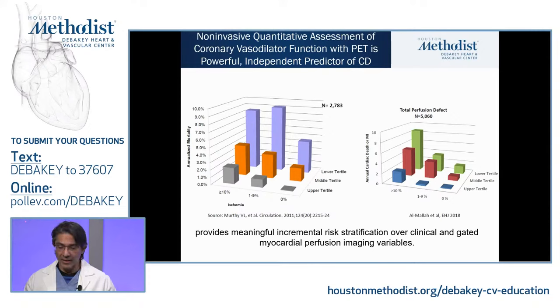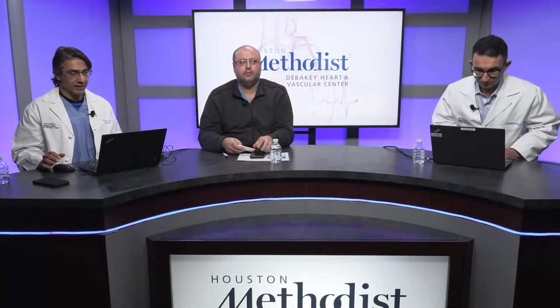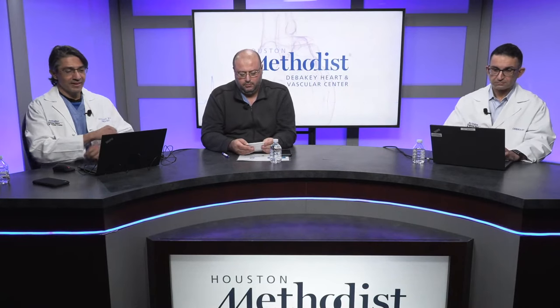Also, if you add to that what your coronary flow reserve is, you can also see further stratification. So coronary blood flow can be a very powerful prognostic independent predictor. You can see here patients who have normal perfusion, but as they get worsening of their coronary blood flow, these patients are at increased risk for cardiac death or myocardial infarction. So I hope that's given us good insight into basics, and in the next few cases that Dr. Pournazari will share with us, we'll apply some of these principles.